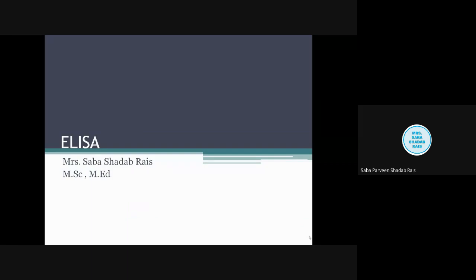Okay, students, now we will be talking about the ELISA. As I had earlier told you, ELISA is the enzyme linked immunosorbent assay. Assay means type of testing. Laboratory testing diagnosis is called the assay. So it is enzyme linked.